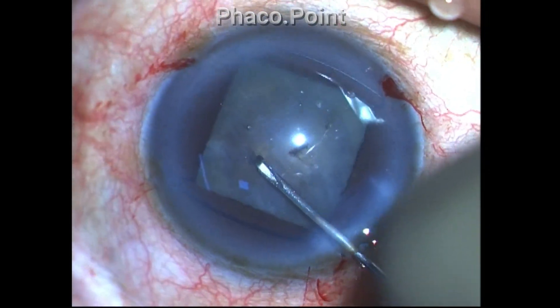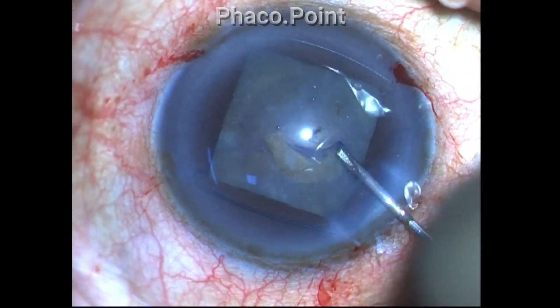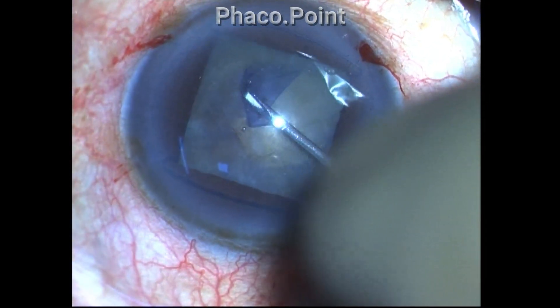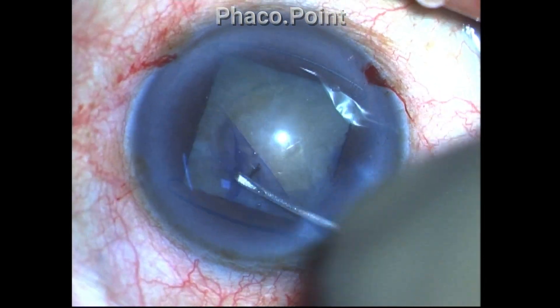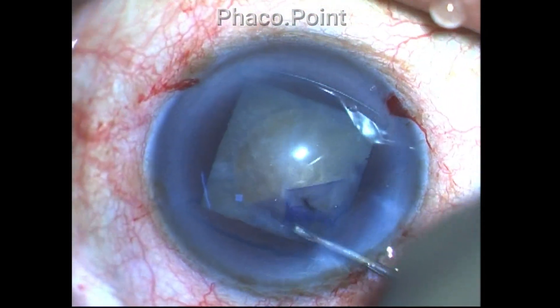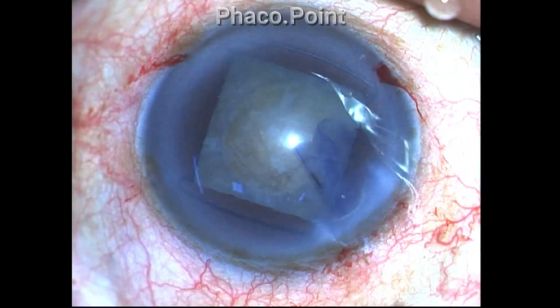The capsulorexis is being fashioned so that it is at least 5.5 millimeters or even slightly larger. This large size of capsulorexis will greatly facilitate the management of the nucleus disassembly — it will help in mobilizing the pieces and also in emulsifying them.